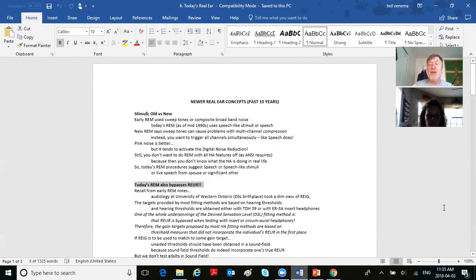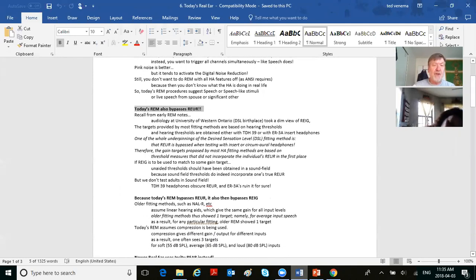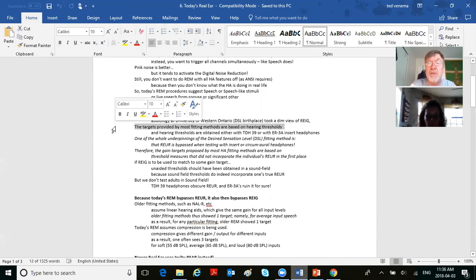Today's real ear bypasses R-E-U-R. We'll first read this and then I'll go into the PowerPoints and describe. So first the meat and potatoes and then the dessert. At any rate, today's real ear measurement bypasses REUR. Recall from earlier notes of Unit 5, Audiology at University of Western Ontario in Canada, the birthplace of DSL, took a dim view of real ear insertion gain. The targets provided by most fitting methods are based on thresholds, and thresholds are obtained with headphones.